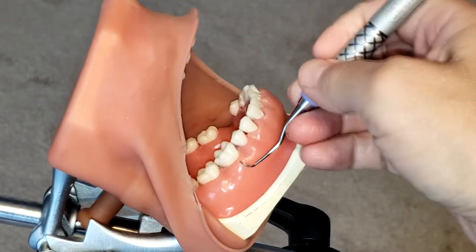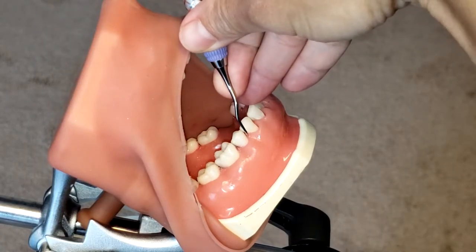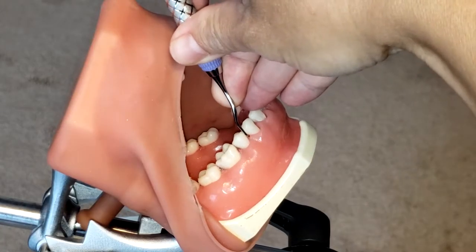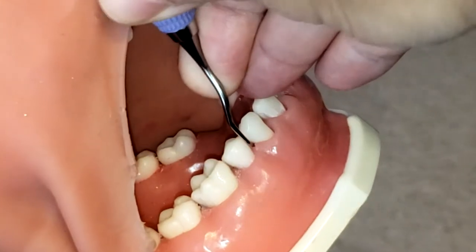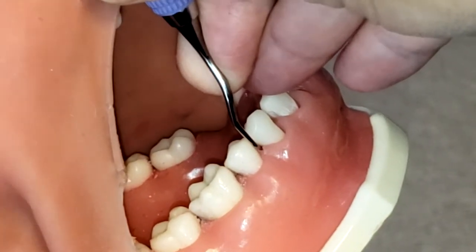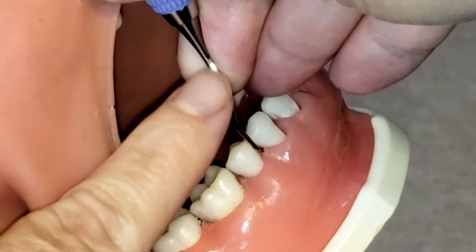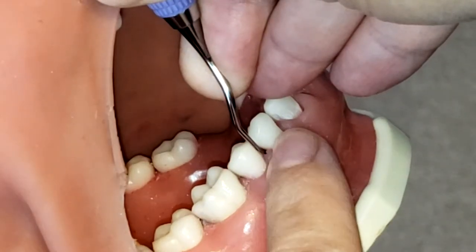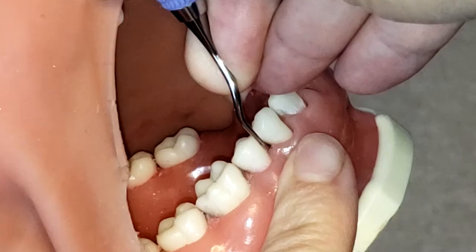First, before we begin, we should identify the correct working end. One way to do that is to place the instrument right in between the two premolars. You can use the two premolars as your guide, and if you take a closer look you see how the lower shank is parallel to the long axis of the tooth and it creates a little V on the bend. That V is created on the distal of that premolar, and that is how you know that is the correct end.